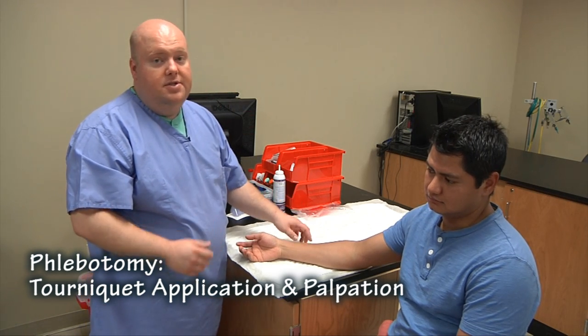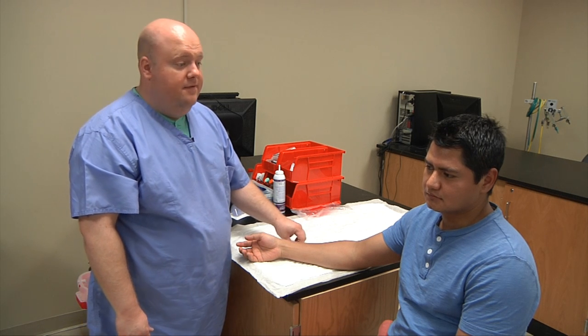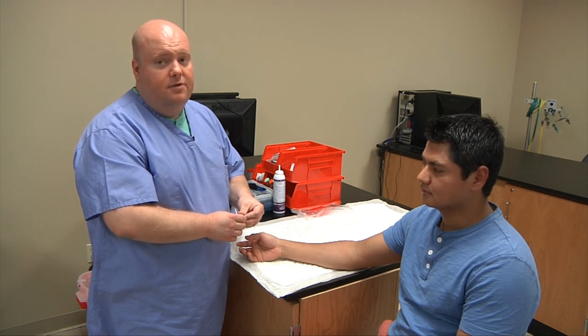Today we're going to learn how to do a tourniquet application and we're also going to learn how to palpate for the veins that we will be accessing for phlebotomy.